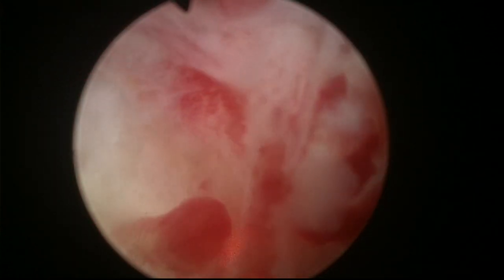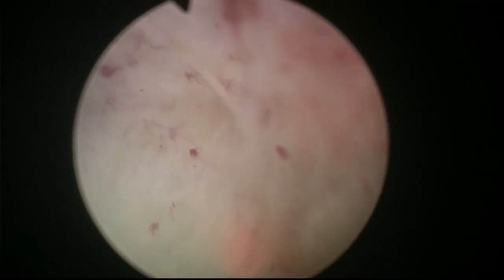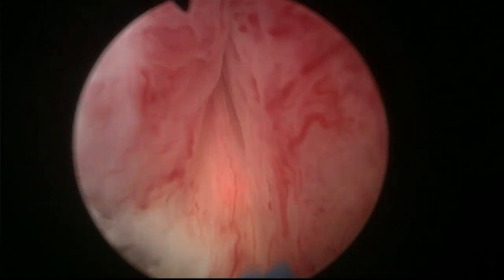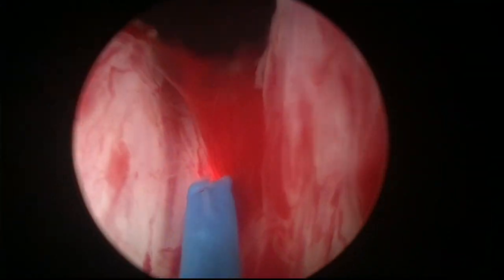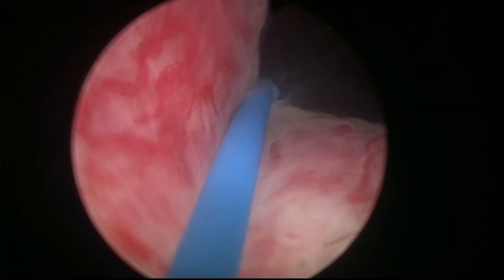At the beginning of the procedure we already know where the plane is. Now we can go — if you prefer to do a three-lobe technique, we can choose to do incisions. So let's start on this side; I'm going to start making an incision.